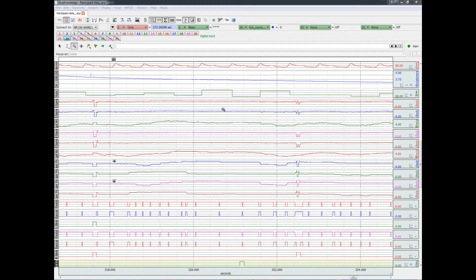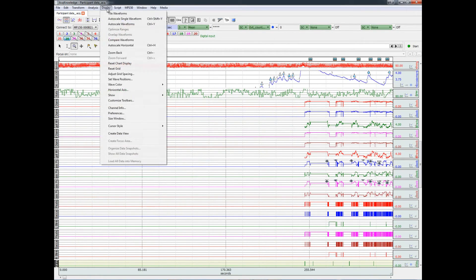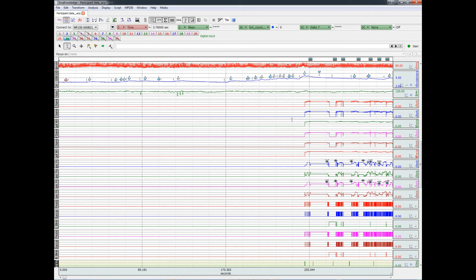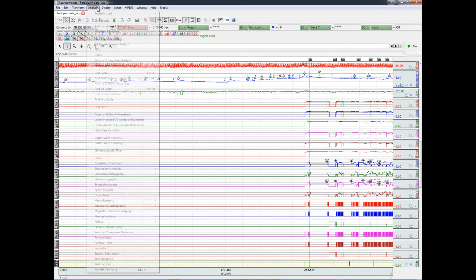Now that we have the physiological data and the eye tracking data in the same synchronized data file, we can explore the relationship between them. For example, we could calculate the mean heart rate for seven seconds following each stimulus presentation.